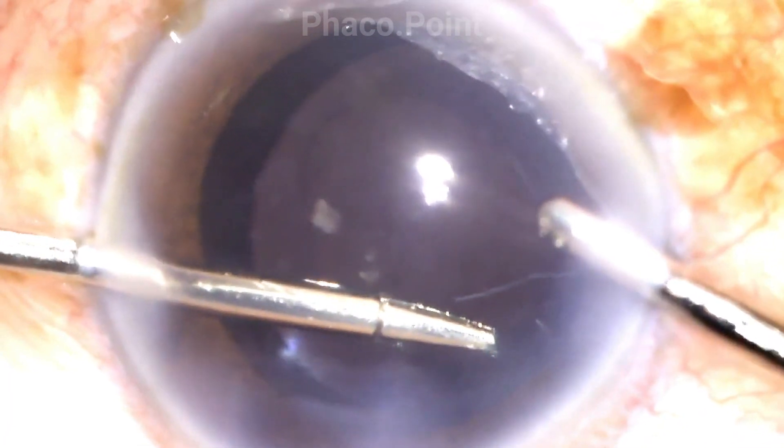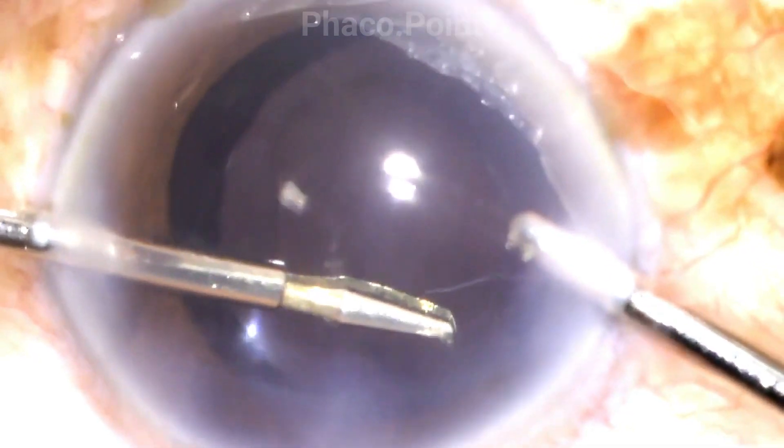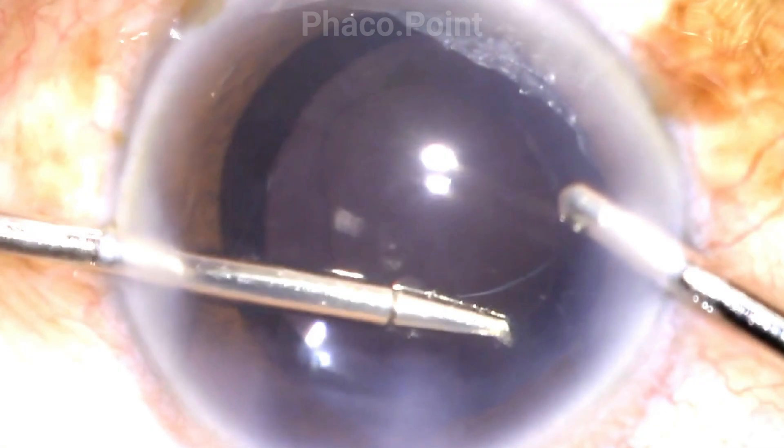The second important point is to ensure that your side port incision is large enough to allow for the free movement of the intraocular forceps within the eye. Please ensure that when you go to hold the capsulorexis edge prior to tearing it, you are working with good illumination, high magnification, and a perfect focus on the anterior capsule. Stromal hydration of the neighboring side ports or main incision can sometimes hamper visualization of this step, so ensure all the above criteria are met.